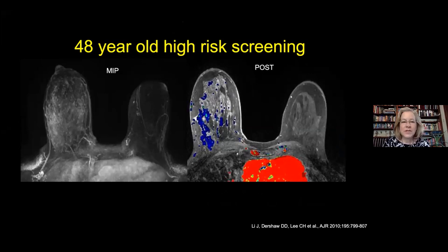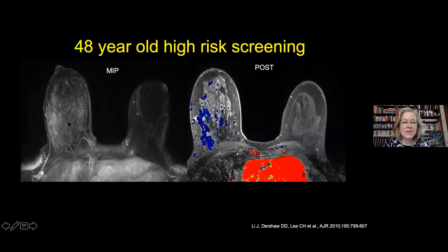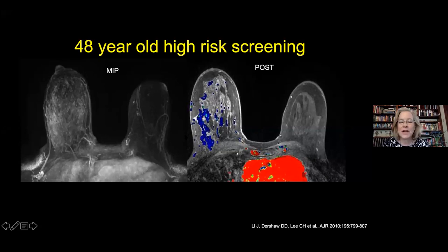Here's a 48-year-old high-risk patient with really marked background enhancement on the right breast and really minimal enhancement on the left breast—a very asymmetric pattern, also visible on the color map. Her left breast also looks smaller than the right. When you see asymmetric enhancement, it's very important to know what's going on clinically.